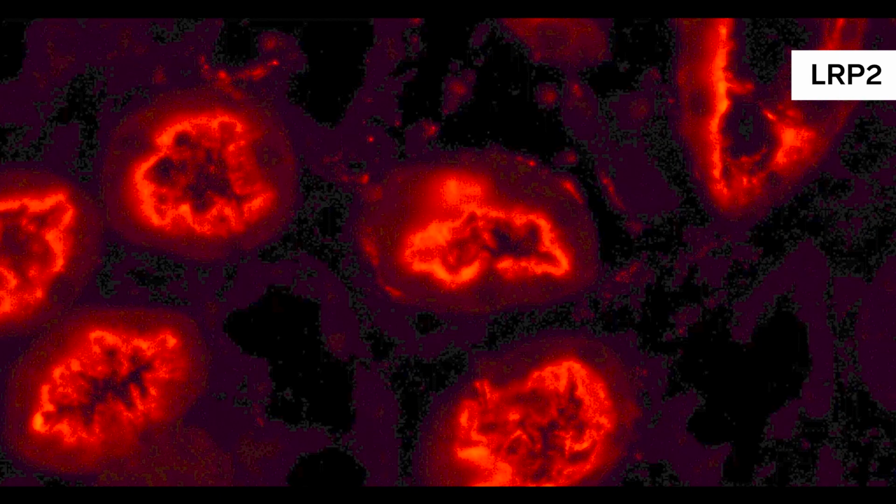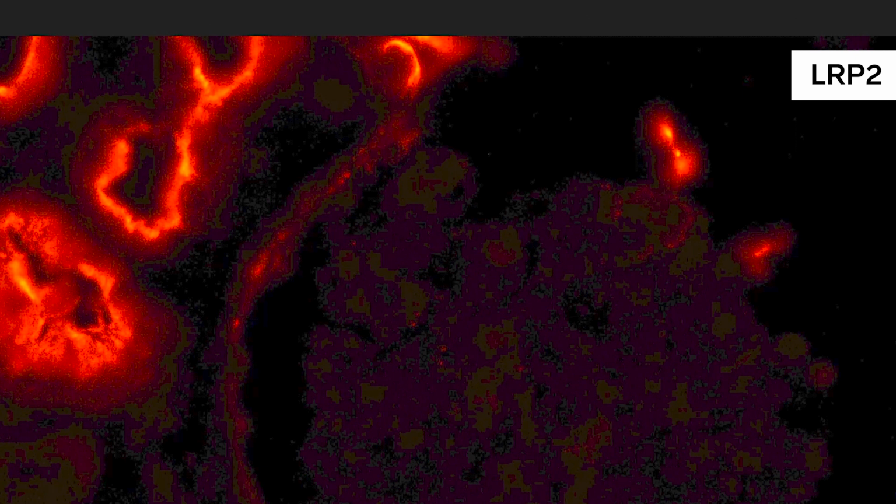So we can see a patchy positive granular staining along the tubular basement membrane, which means that the stain is positive. So here's another picture where we can see again our control is the brush border, and then we have the tubular basement membrane staining too. And on this picture, we can also see it's highlighting the Bowman's capsule and also where the segmental capillary loops are.